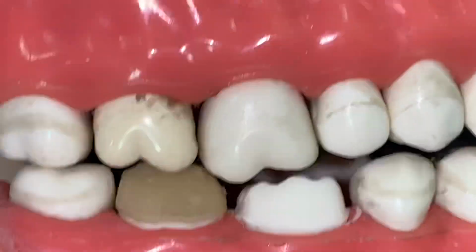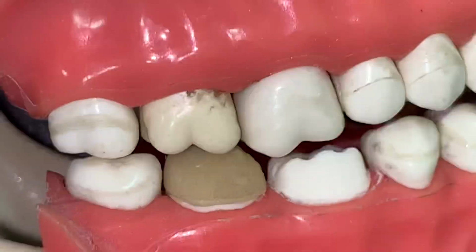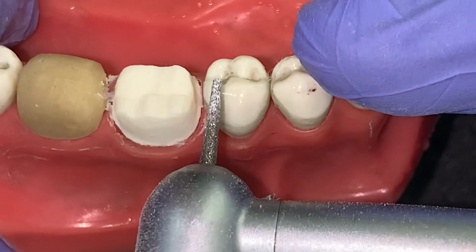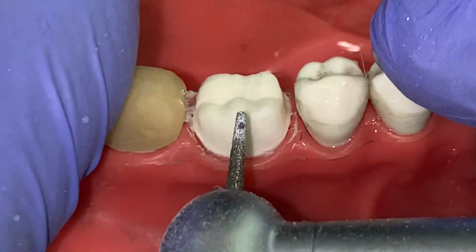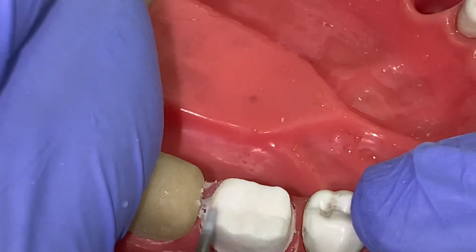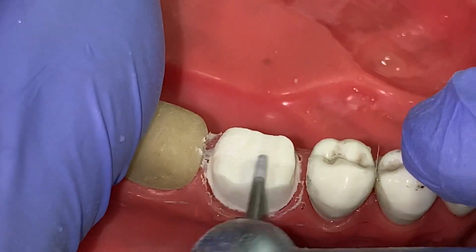So what I am showing here is we need sufficient occlusal clearance, and this is the back of any burr that you can use to just check if you have sufficient clearance. This is approximately 1.6 millimeters wide in diameter, the back end of any burr. So you can use it to just verify that you have enough clearance, and wherever it is getting stuck, you can finish the preparation there. You can further reduce that area. It is an easy way to find out if we have enough clearance or not.